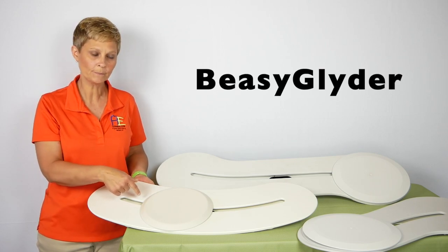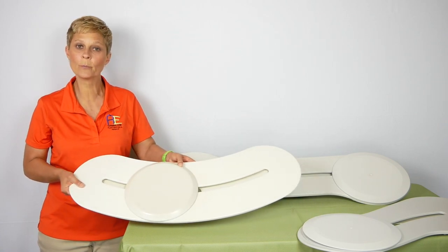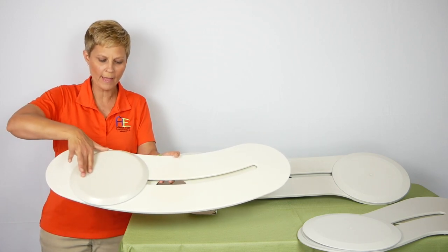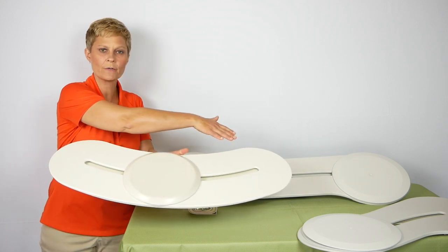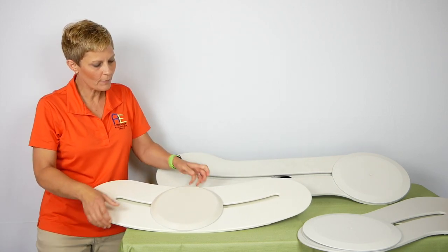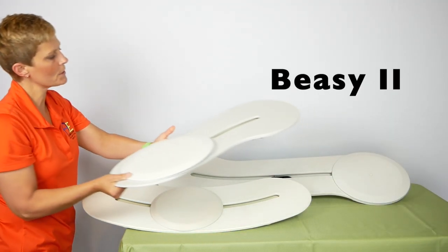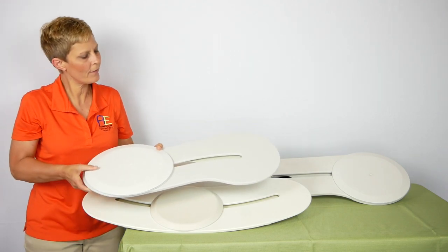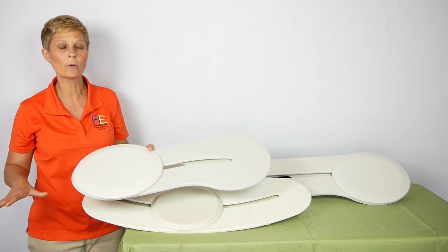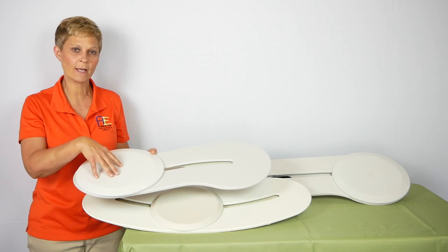This is called the BZ Glider. This is useful in a situation where you have a wheelchair that has non-removable arms — it allows you to go around that arm to the other surface you're looking to go toward. Then we have a shorter board called the BZ2, used in cramped areas like the bathroom, from a wheelchair to a toilet or to a tub transfer bench.